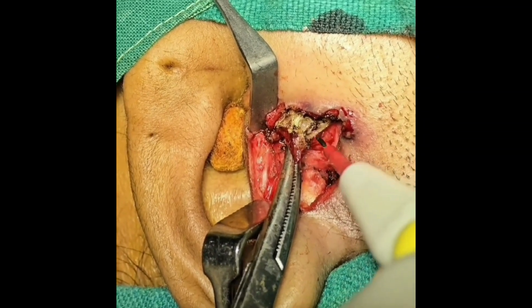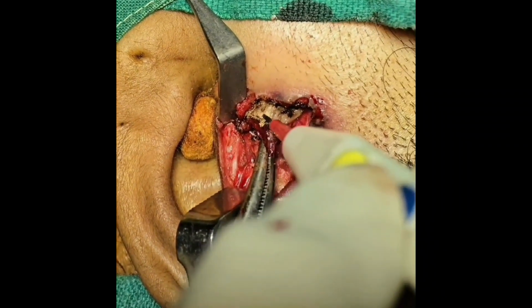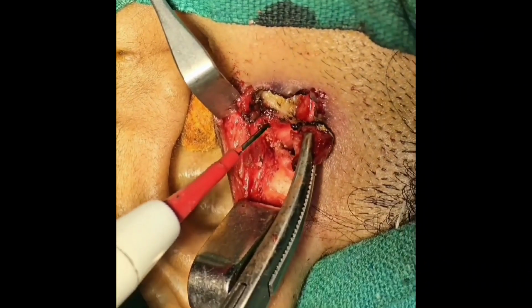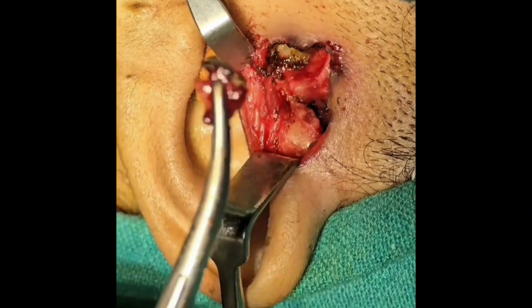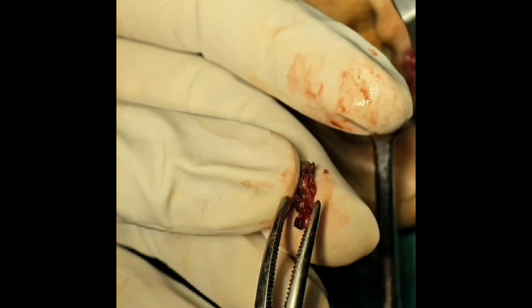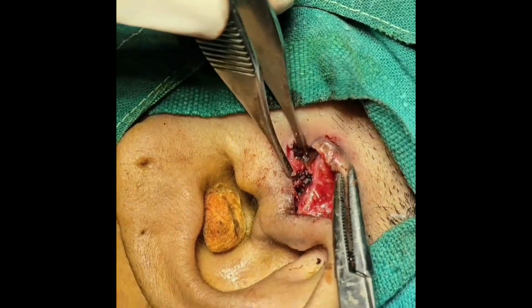the previous abscess area, the preauricular abscess, because this skin will not be viable, and I do not want the patient to have a bad scar post-operatively. So I have removed that unhealthy skin and the adjacent subcutaneous tissue.